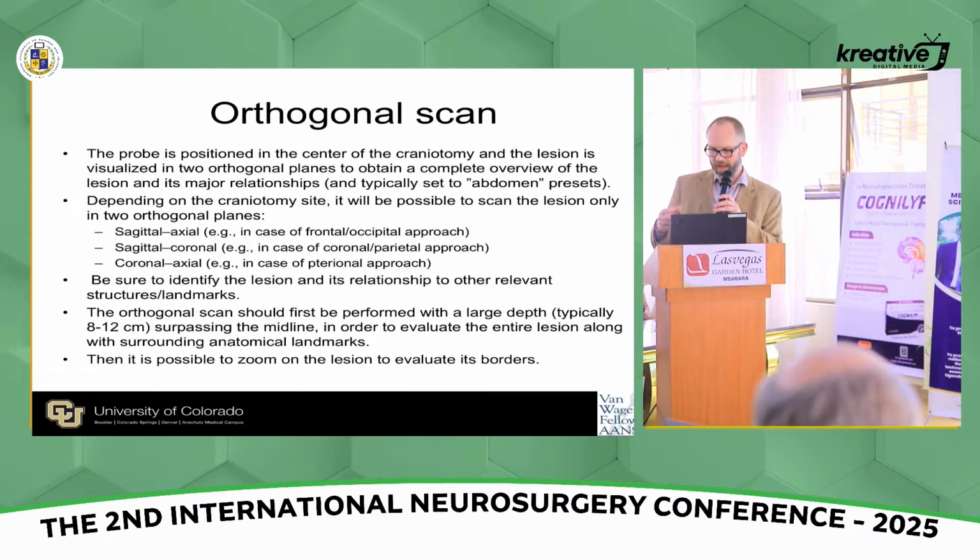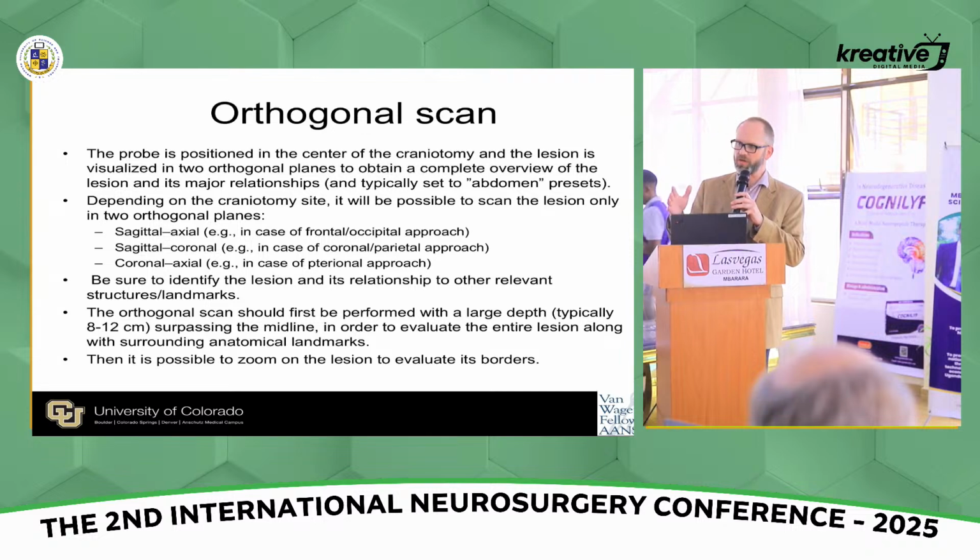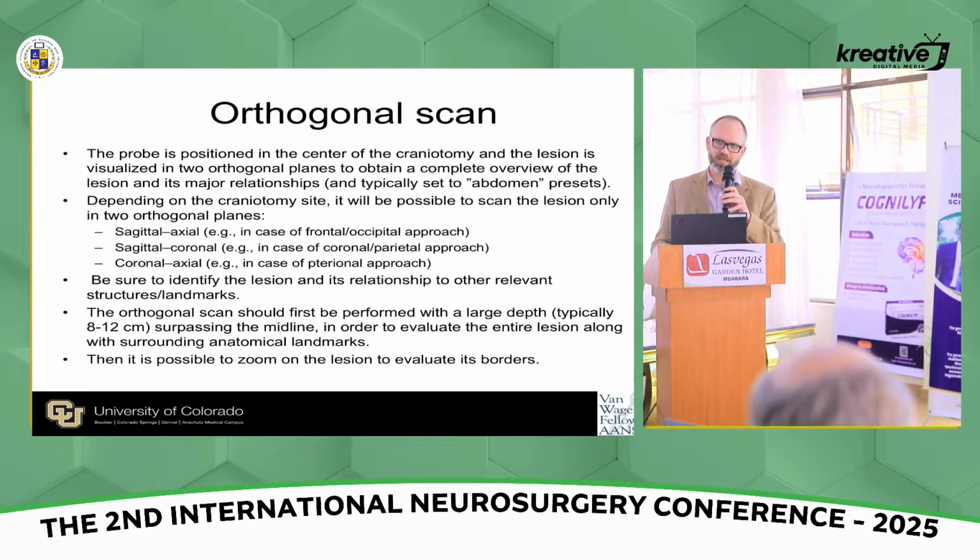And then I get a few scans during the resection if I'm doing a tumor, hematoma evacuation, or an abscess drainage, let's say, and then a scan at the end, post-dural closure, to get a nice control ultrasound to make sure you don't have any post-operative complications like a large hematoma in the cavity. So I've just said all these things basically just to save us some trouble.